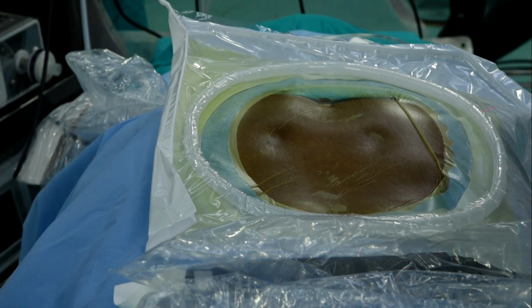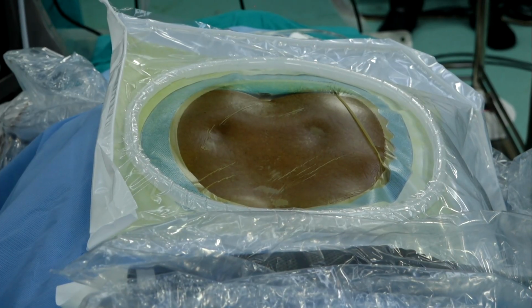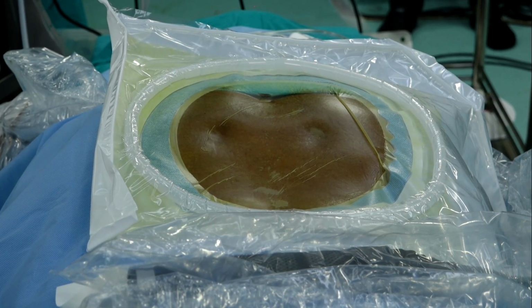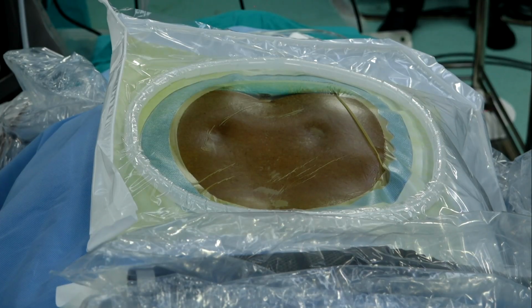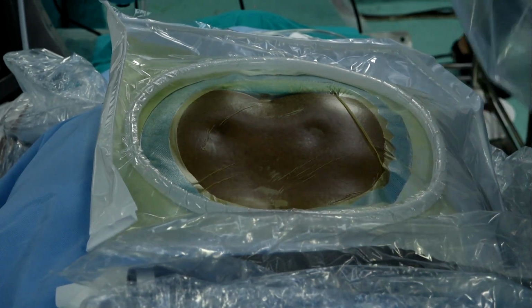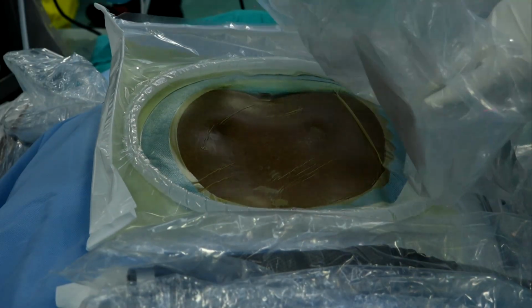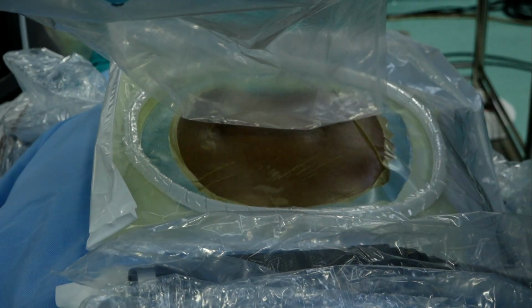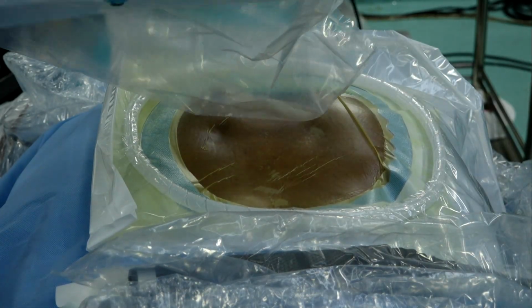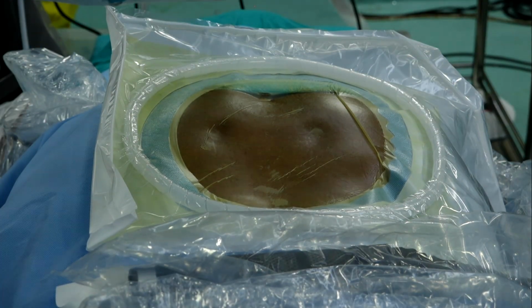So in the meanwhile, sir was speaking about sacralization, right? Ideally for any MIPSI procedure of the spine, or for anything else, what is important is we always know our target. In about 30 to 40% of the procedures that we do, most of the times we see either a lumbarization or sacralization of the spine. If you are not aware of it, and don't correlate the MRI with fluoroscopy on the table, we might be doing our MIPSI intervention at the wrong level.